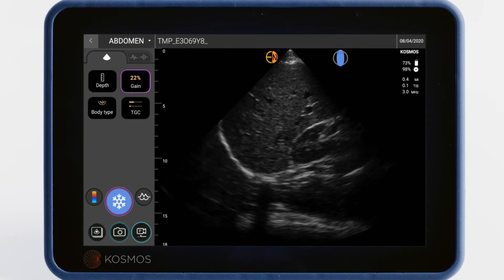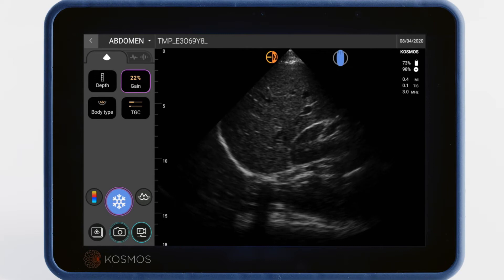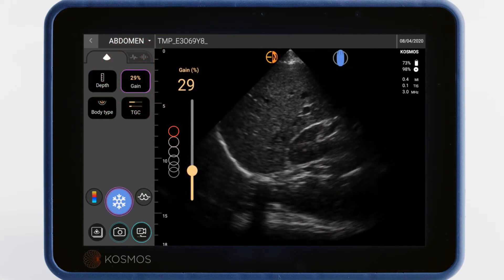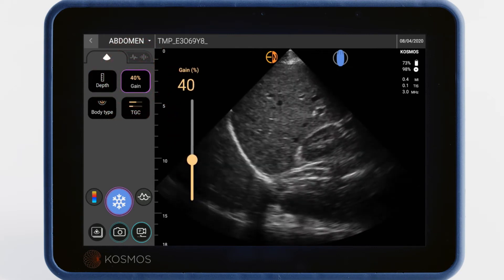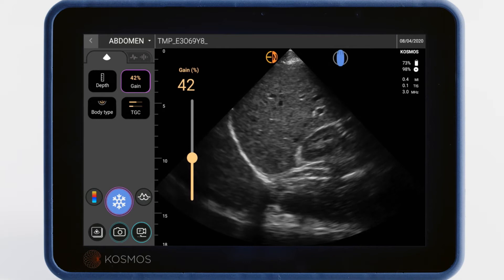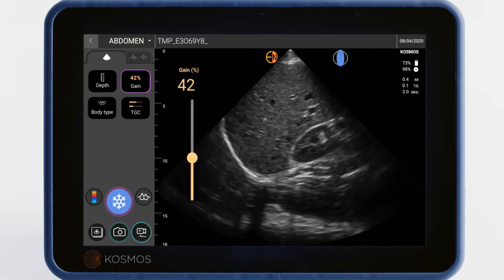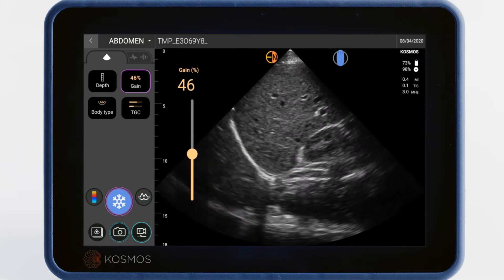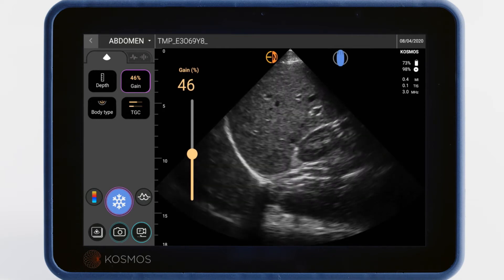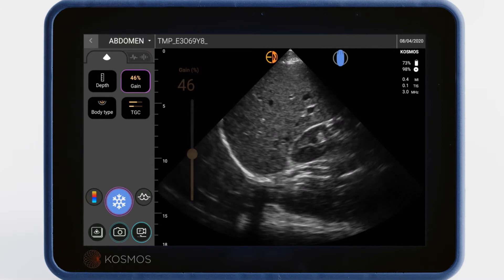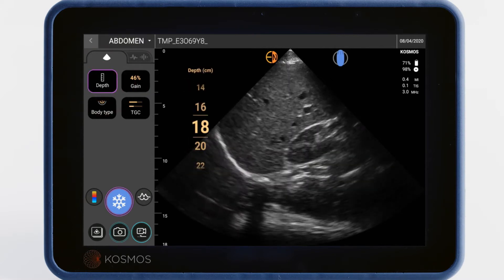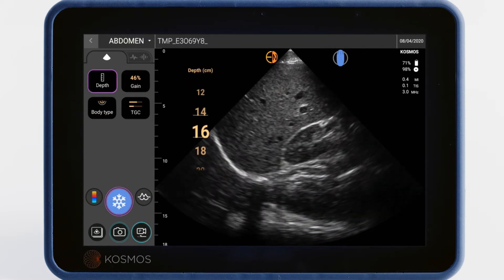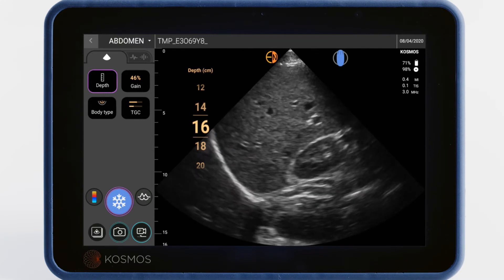You can adjust your depth or gain by tapping on either icon and dragging your finger as if it were on a slider right on the touchscreen. You may want to adjust your gain when the image appears too white or too dark. Adjusting your depth is appropriate when you want to see more or less of the patient's organs.